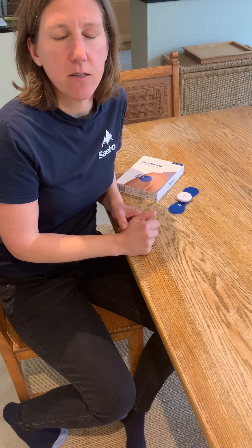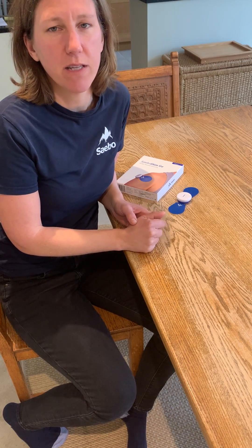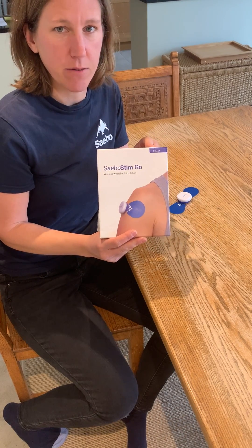Hello, my name is Amy. I'm the clinical specialist with Saebo UK, and in this video I'm going to show you one of the easiest to use electrical stimulation devices out there, which is the SaeboStim Go.